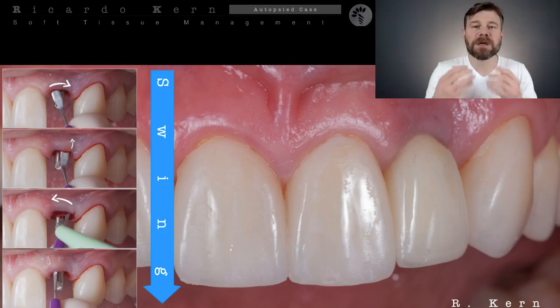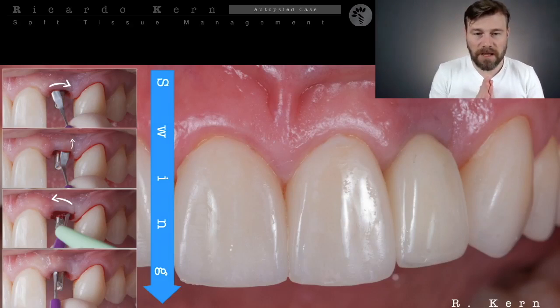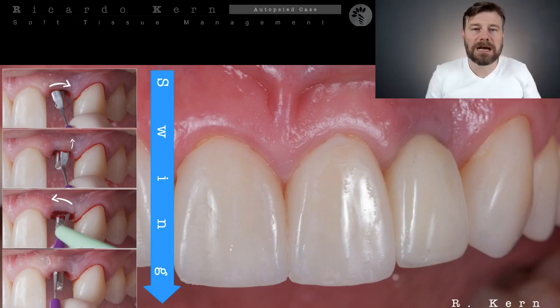And if you decide to approach this kind of surgery, you're going to have two main options to approach a case like this one, okay? So I'm going to show you some options that you may have to treat a case like this one, right?